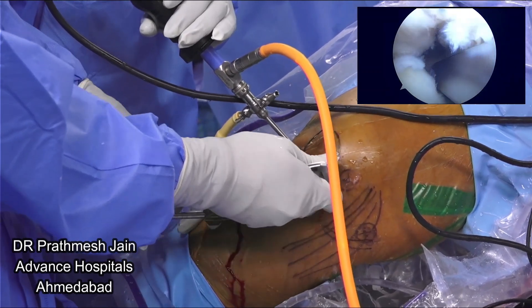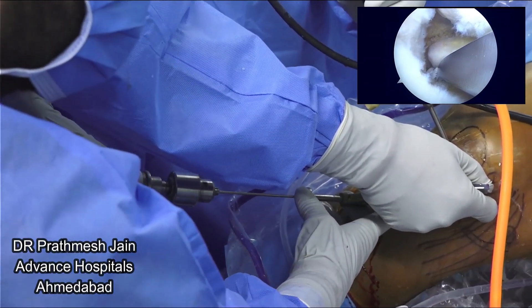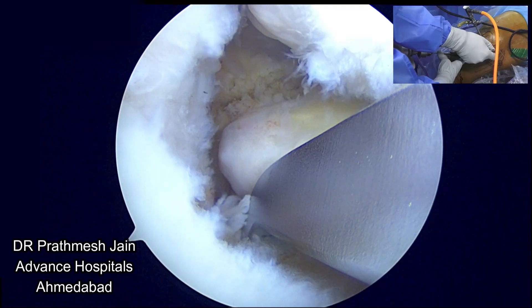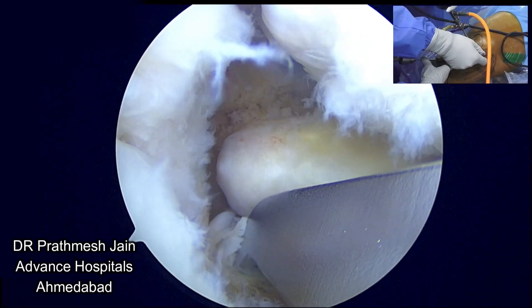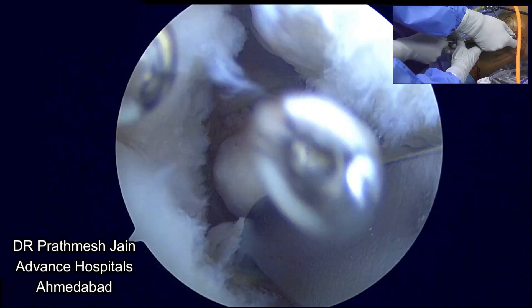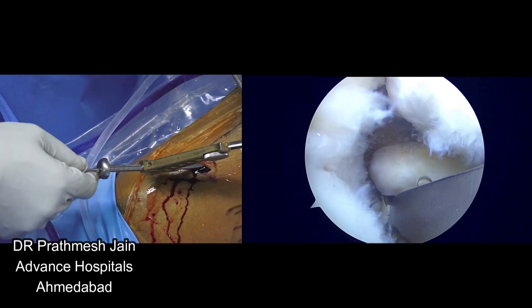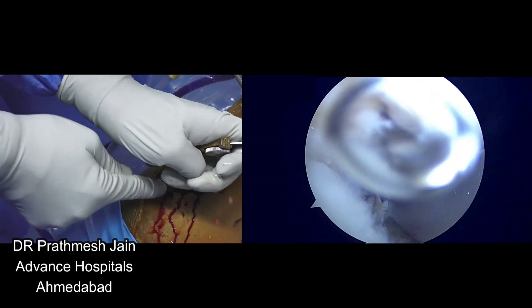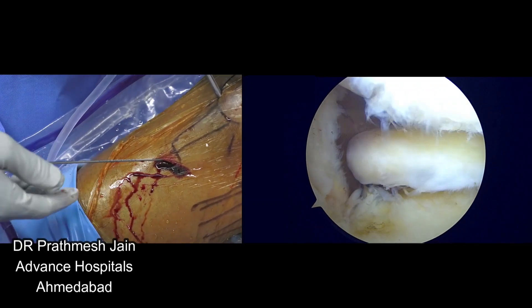So what I do is I will put my — so we are drilling the meniscus tunnel, the meniscus root tunnel. You can see that it has exited at the perfect position of the root attachment. The system comes with a spinal needle which is long; the spinal needle goes into the same trajectory where you have inserted the drill, and then you can just take out your jig, your bullet, and now you can see that it is exactly at the place of the root attachment.